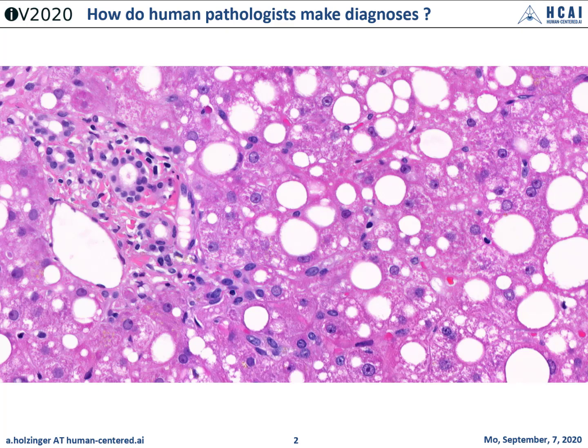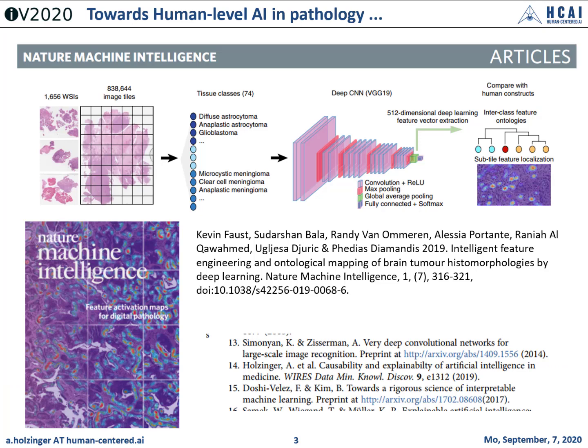It is important to note generally that in the medical domain, different modalities contribute to one single medical result. So, current AI is very successful in object recognition, in quantification, and can also perform complex classification tasks. So current medical AI is already able to reach human level performance.